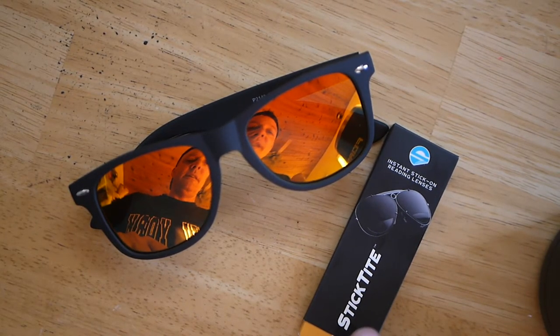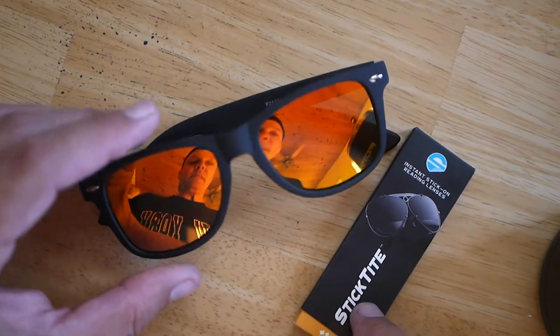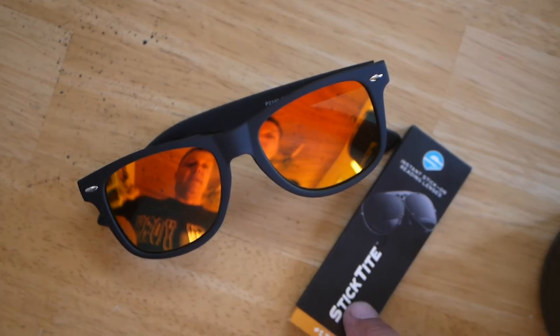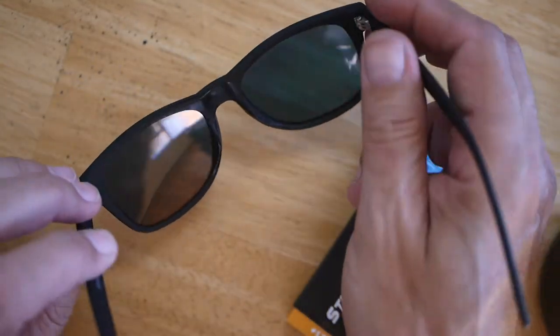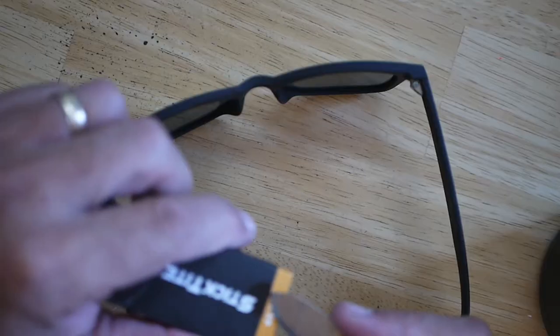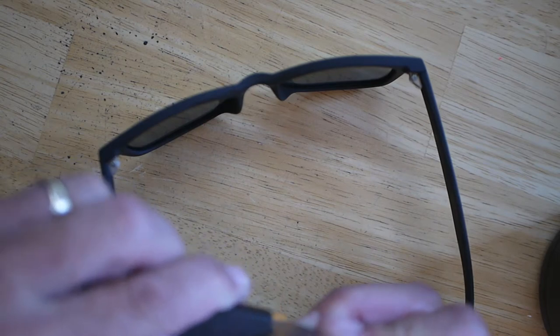I need a pair of polarized sunglasses that I can use when I'm out on the water — fishing, tubing, whatever water activities I do. I know I need these polarized glasses so I can actually see. But at the same time, I may come to a point where I need to read something.